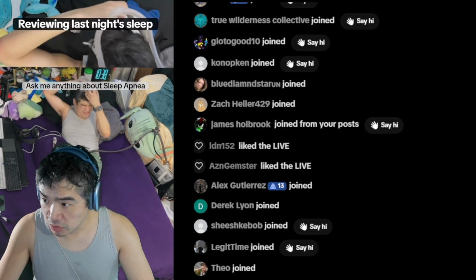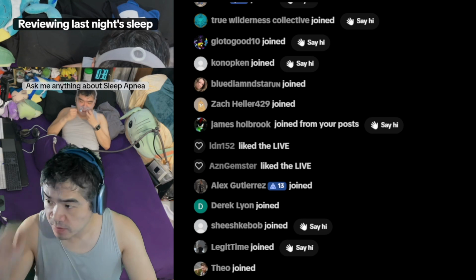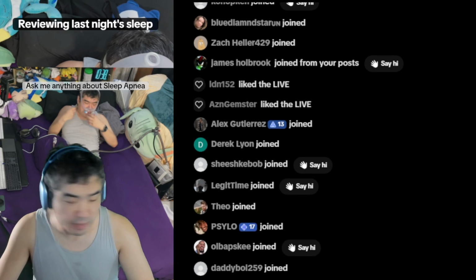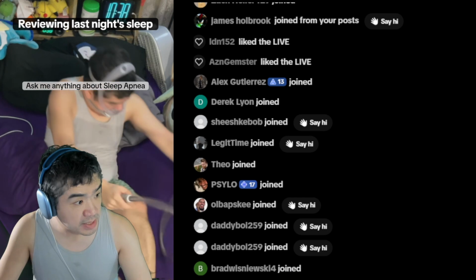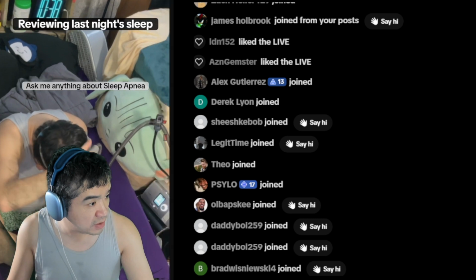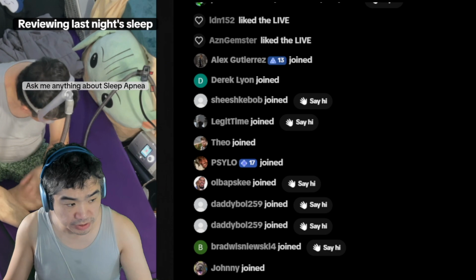All right. So if anyone doesn't know what sleep apnea treatment looks like, that's basically it. That's the sleep apnea mask. I'm gonna go ahead and zoom in and give you a little play-by-play of what's happening. Right now, I'm putting the mask on. I'm hooking it up to the machine.